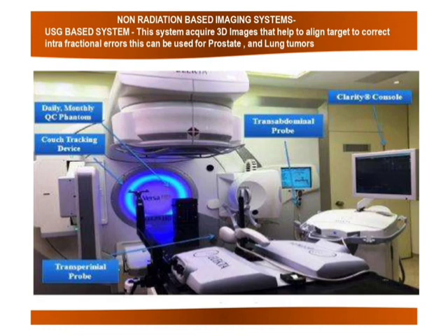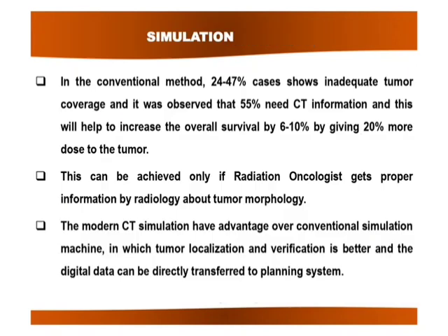A linear array of detectors is mounted on the gantry arm, and digital information of radiation exiting from the patient is acquired by rotating the simulator gantry and the X-ray tube. The advantage of such a CT simulator over the conventional unit is the elimination of spatial restriction on the CT gantry. The patient is more likely to be imaged in exact treatment position, including the use of patient support devices.